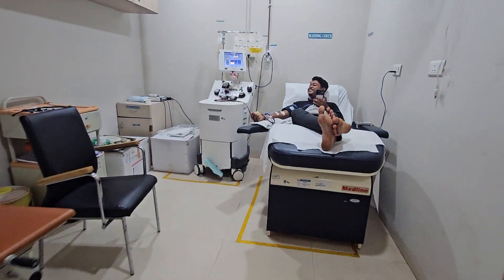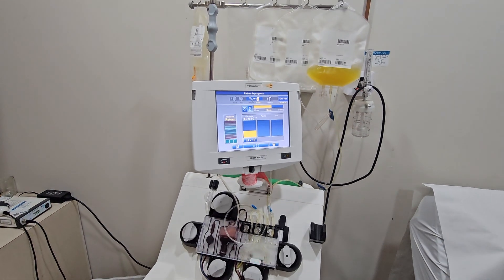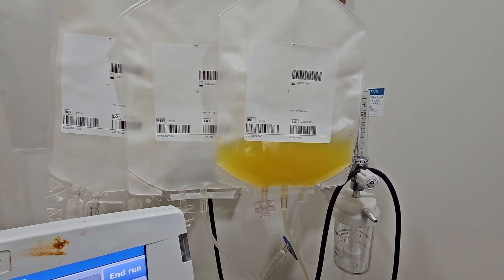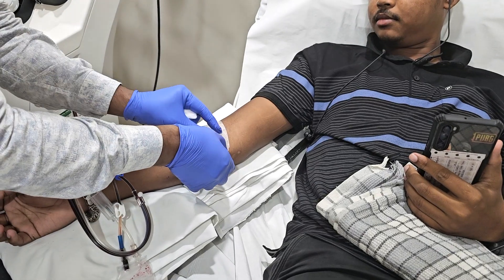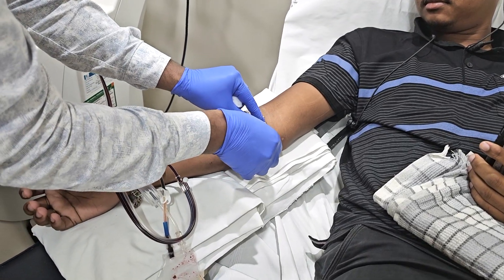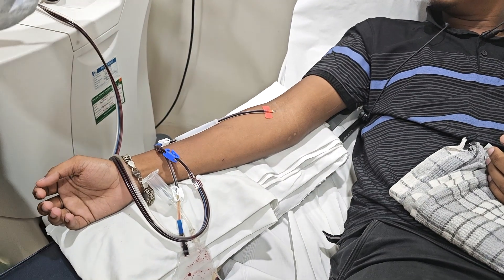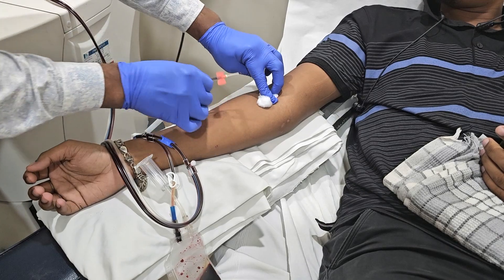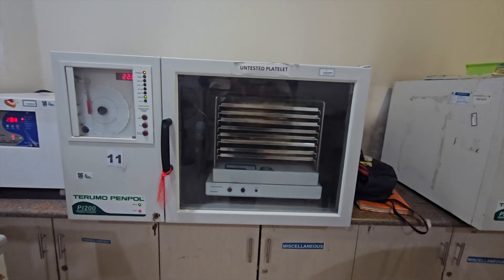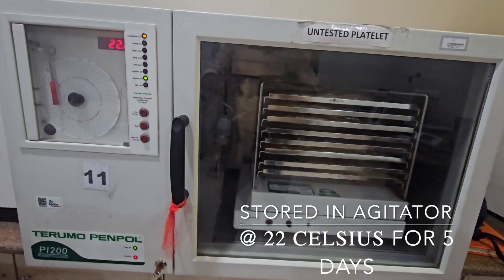It's an easy and pain-free process during which one can watch TV, read, or simply relax. Once the desired volume of SDP is collected, the lines are removed. SDPs are stored in an agitator machine for 5 days at 22 degrees centigrade.